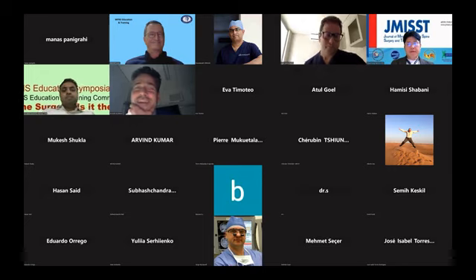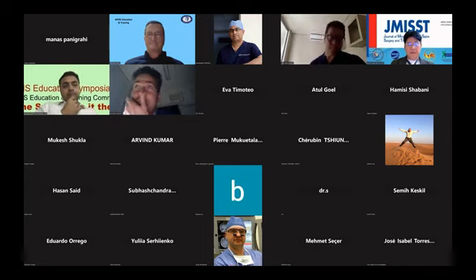Indication. I think if you can read the MRI correctly and you have good preoperative planning and you know the anatomy on the X-ray, if you use the X-ray, you know when the end plates are really parallel, etc., then it's safe to do. But if you can't even read the MRI correctly, you can get into deep trouble.